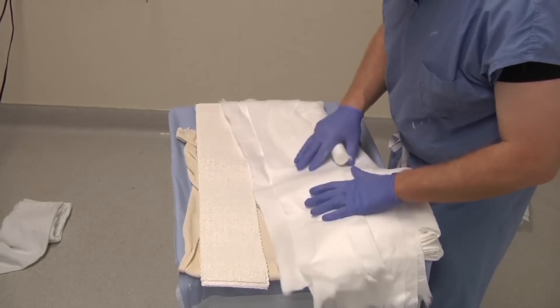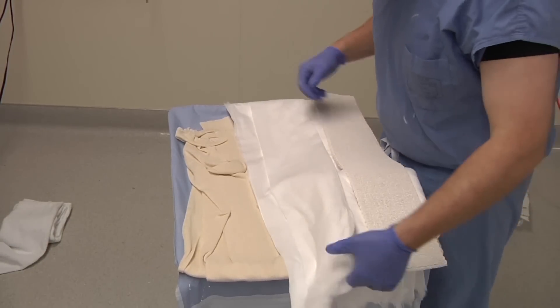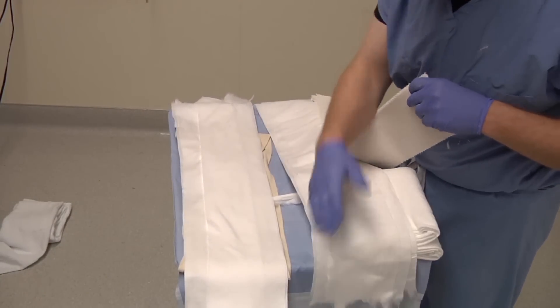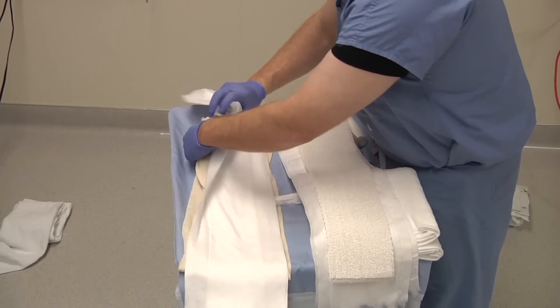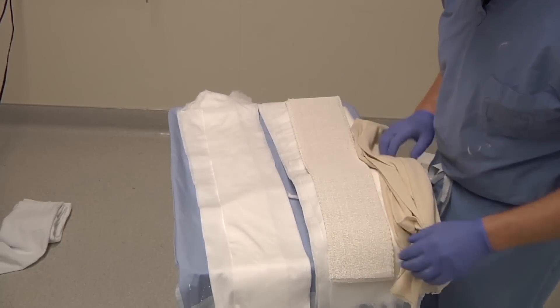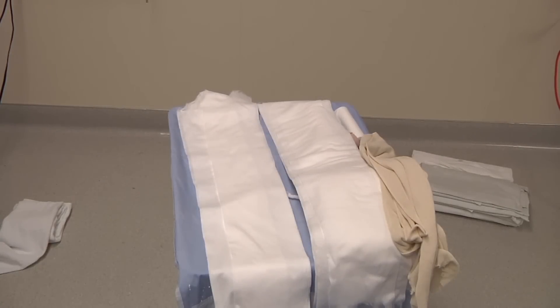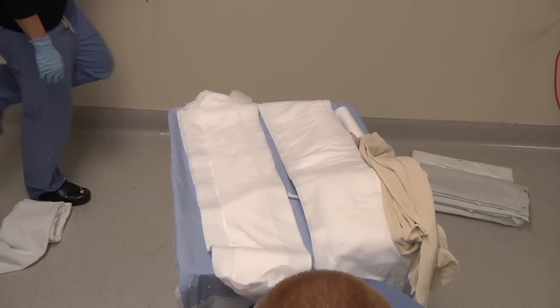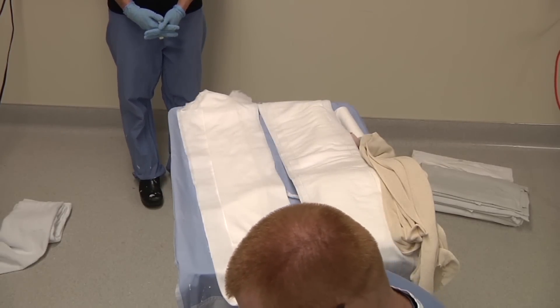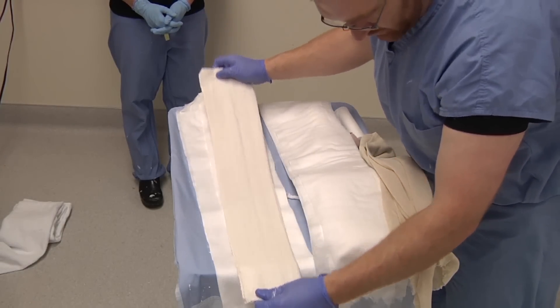Now, as you can see, we have two multi-layer cotton web rolls. Next, we lay them out to make a sandwich and prepare our long strands of tubular bias, which we'll be placing inside. We take our plaster and dip it, making sure to wet it thoroughly, then laminate thoroughly.